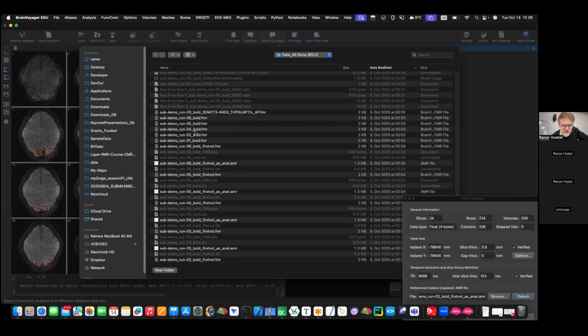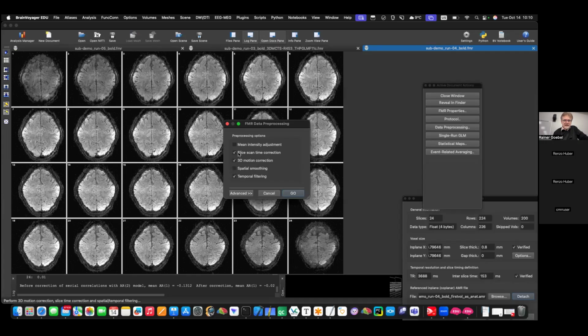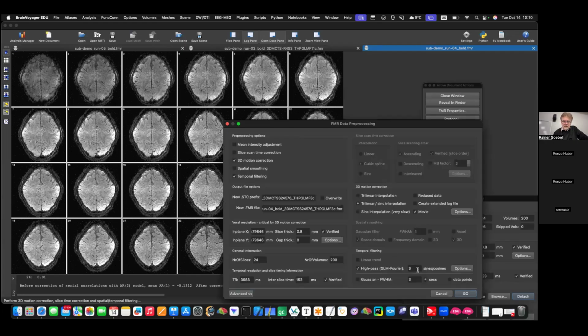I mean, a motion correction. No, the prepared motion correction. So lines 2 and 3. You run it like that, it just runs run 4 and so on. You go into fMRI preprocessing for run 4. Again, you turn off the slice scan time correction, and for the high pass filter, you set this to the value 11. 11 cycles we remove.